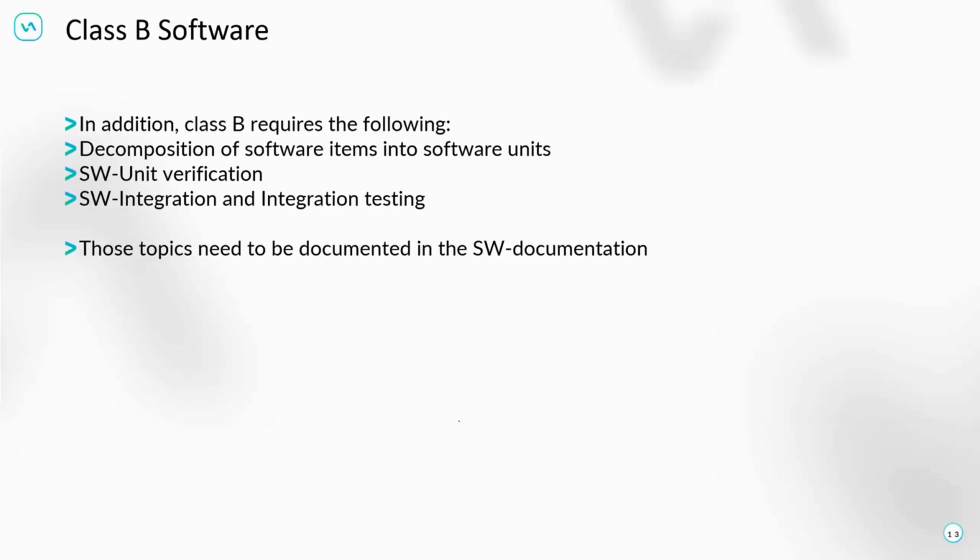However, it can still be done with the same tool set, so there's no need for additional tools. You can reuse that from the past. You can use Doxygen to recreate the same framework, and then you can go. Since you do that additional documentation step on the architecture, you will also need to include that in the software unit verification, ensuring each unit has been at least covered in one of the verification steps.